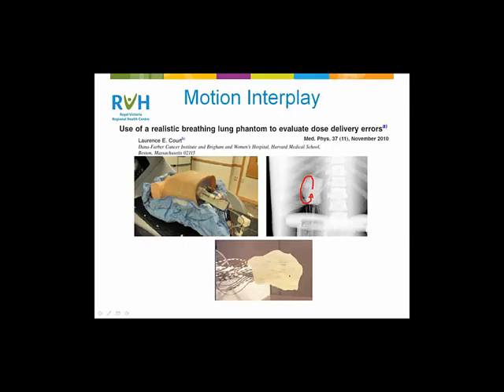We're going to walk through some of the results here slowly. So what we've got on the vertical axis here is the probability that 95% of points are within 2%. So that's in comparing the dose measured in the tumor model to the dose the planning computer had calculated to that point in treatment. And this is a function of the number of fractions. Remember, we're accumulating dose in the entire treatment. So all the fractions are delivered with a dose measurement at the end of each fraction.